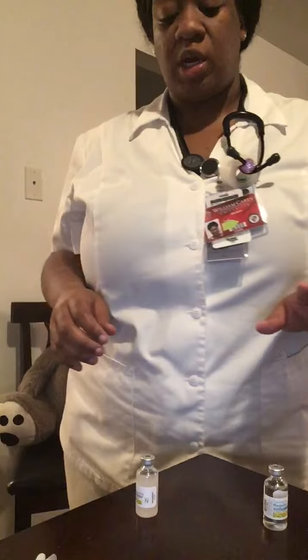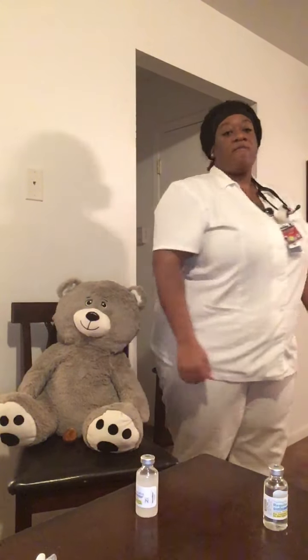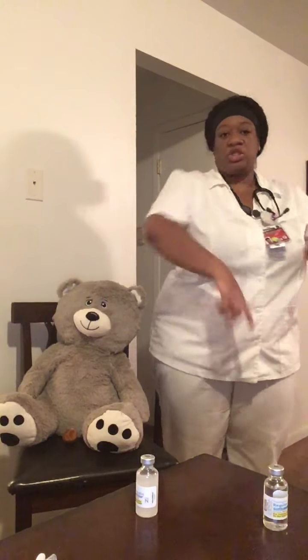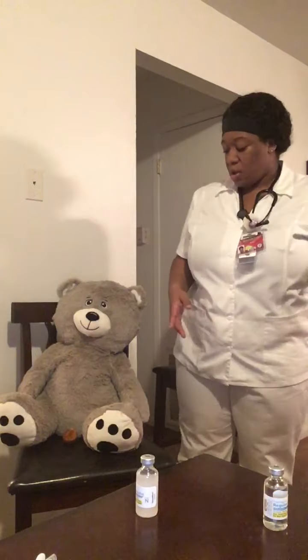I will assess the patient for signs and symptoms of hypoglycemia, the last time they've eaten, or if they're ready to eat something now. I will also assess the last site that they got insulin in, and assess for new areas to inject. Subcutaneous areas that you could use would be the abdomen, the thigh area, and the backs of your arms. The patient said that their last injection site was on the back of the arm, and they stated they want their new site to be the thigh area.